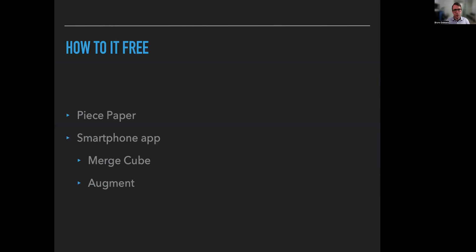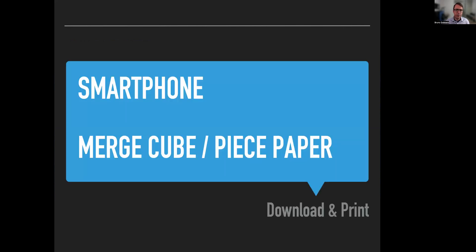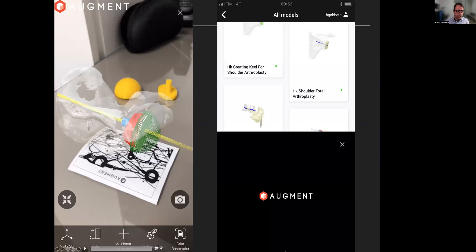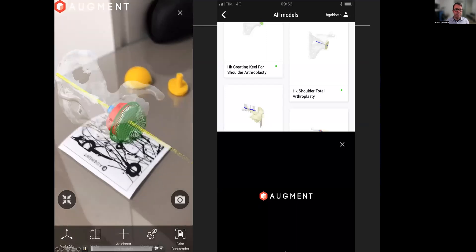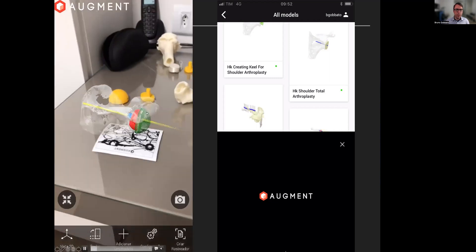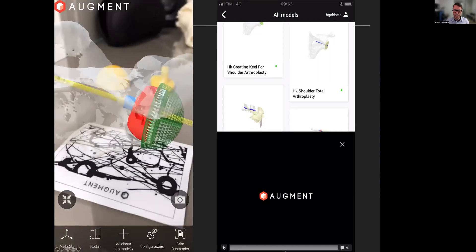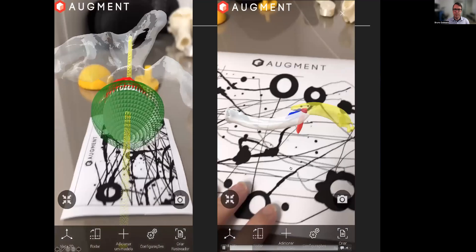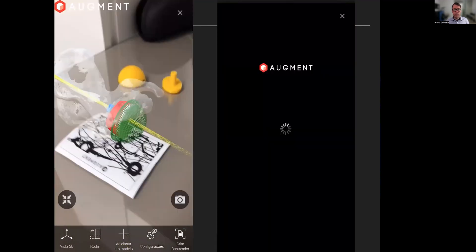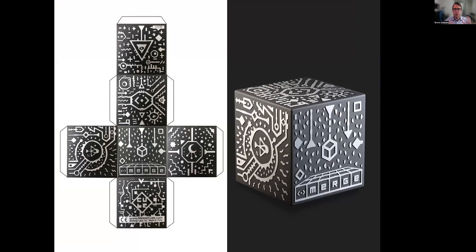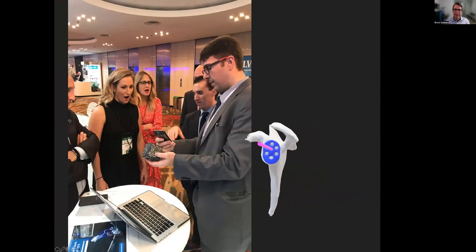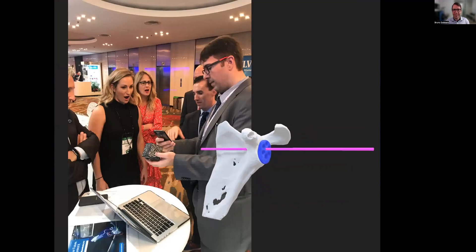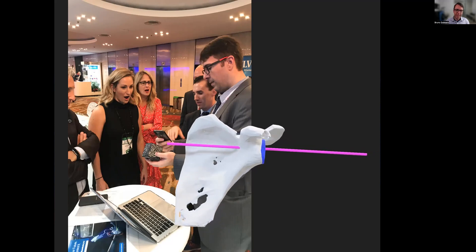Can we do it free? Yes, we can today. We can do augmented reality with a piece of paper and a smartphone app. We can use an app called Augment, and here we can see the planning of a reverse total shoulder arthroplasty, even with the graft shown in red, or we can see the planning for a clavicle fracture using our smartphone and a very simple piece of paper. We can also fold that piece of paper into a cube — called the Merge Cube — and here we are showing at the Exactech booth a planning of the Exactech implant using this kind of technology.